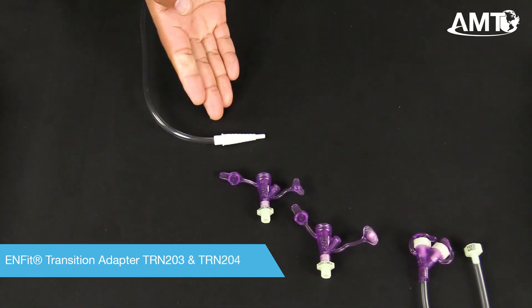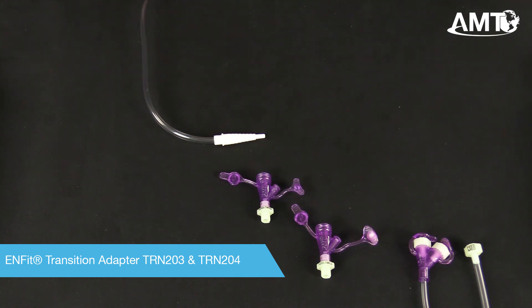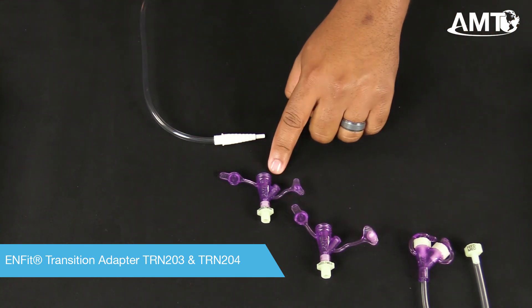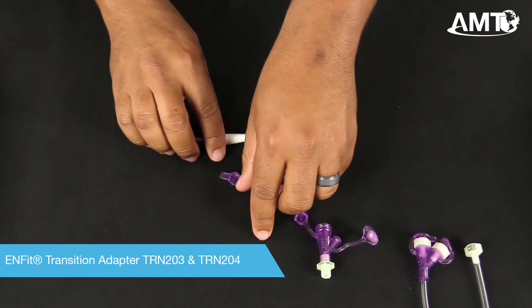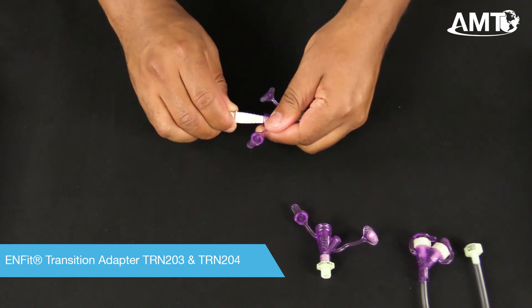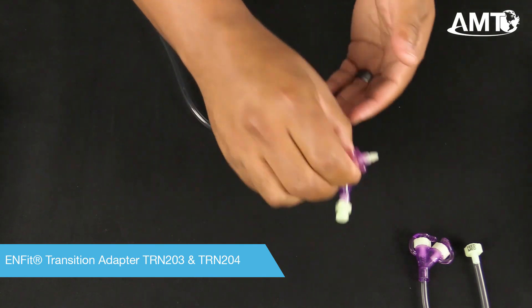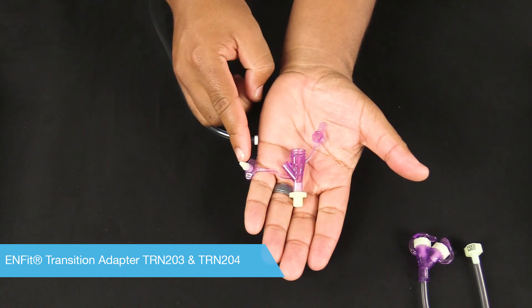If you have a legacy administration set with a fixed-stepped adapter and need to connect to an InFit feed set, you can simply attach TRN-203 or 204. TRN-204 features the enhanced MedPort plug.